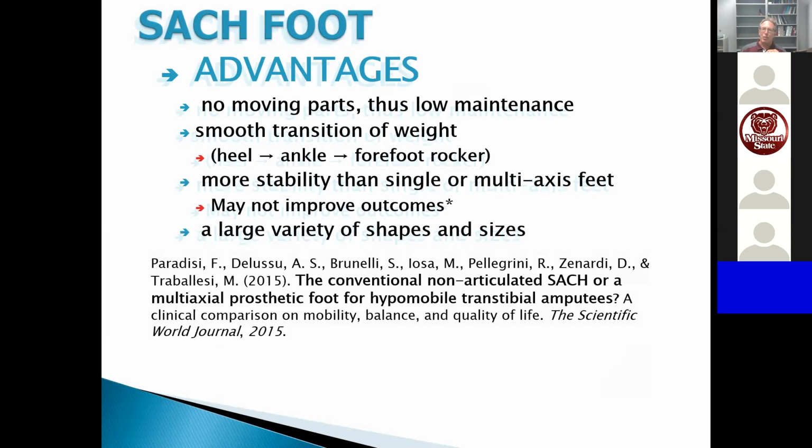For a couple generations, from the end of the Second World War, when this was first developed and prescribed for lower extremity prostheses, through the early 2000s, it was assumed that if you were weaker, if you were older, you needed something like a SACH foot because it has no moving parts. And moving parts are harder to control.